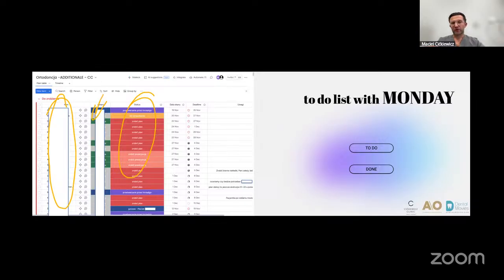And it's good to set up the deadlines, because then we will have the slot of our time. If we have to postpone, then we change our deadline. But of course, as you can see here, the option is that we are going out of our deadline here, and here we also have the margin inside, because we don't want to change our dates. Also here we have the description, because sometimes the patient needs passive aligners, or we would like to not go inside to the elements of the cards.